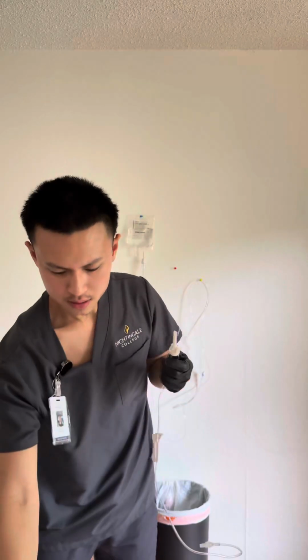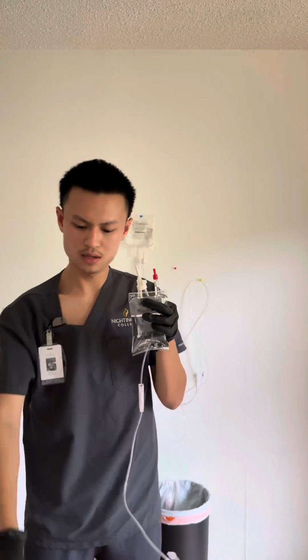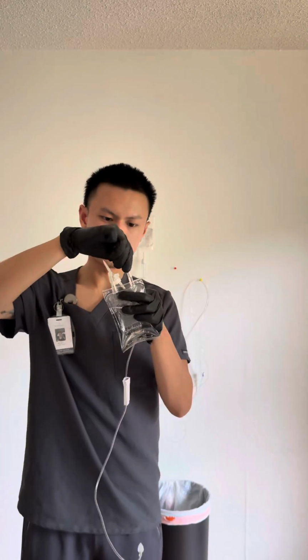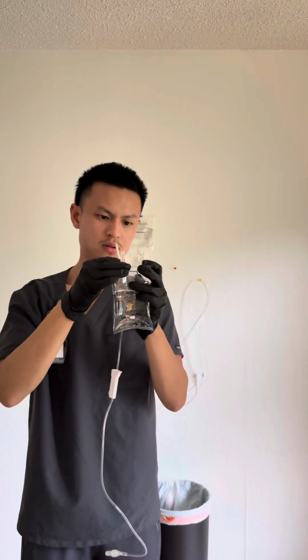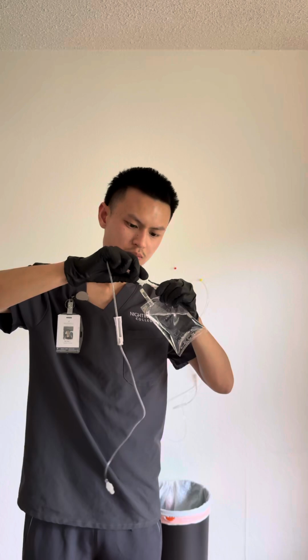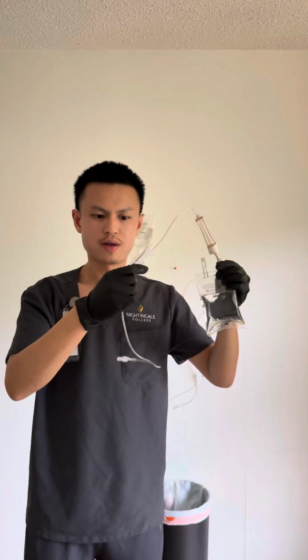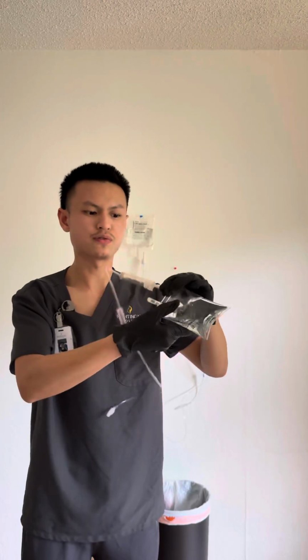Now with my secondary tubing, same thing with the medication. I'm going to remove the cap for the secondary tubing and then the cap for the medication. I'm going to spike it, making sure that the roller is in the off position so that fluid does not flow out of the tubing once flipped.